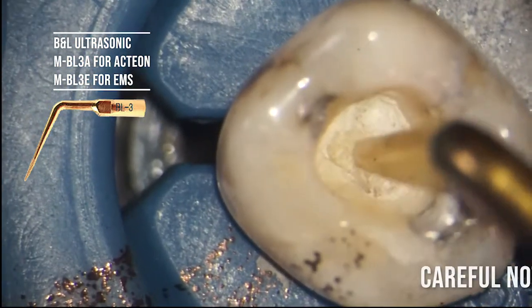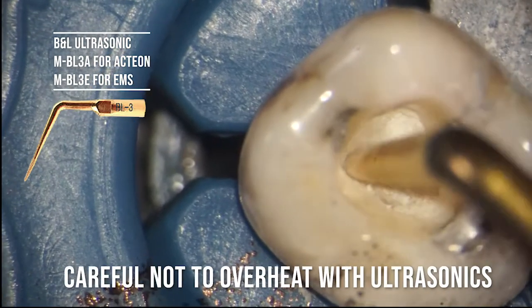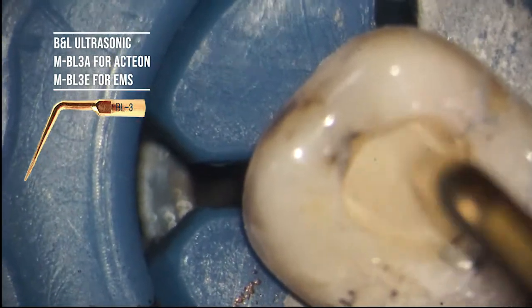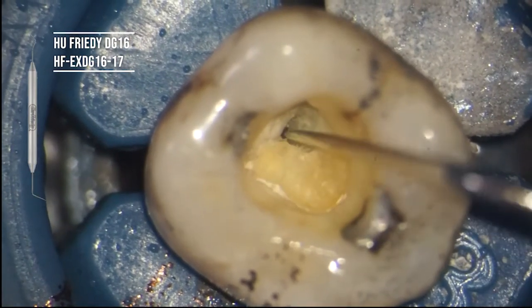We do find it gets a little bit hot, so I'm just showing you this is a slow method of doing it. We can carry on doing it this way, but make sure after 5 seconds you irrigate and cool down that pulp chamber because it's going to get hot. Right, so there's the canal system of the mesial root underneath there, and that pulp stone is really tight.